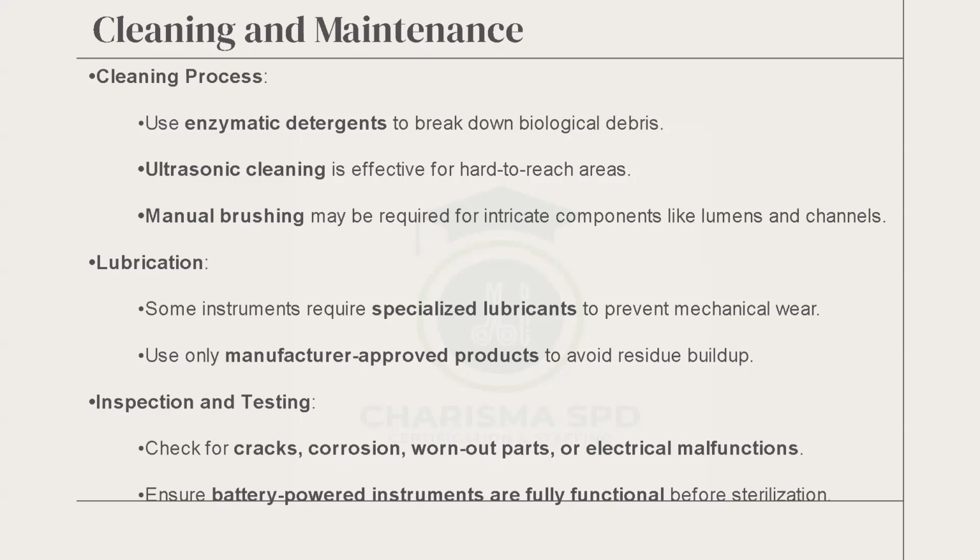Manual brushing may be required for intricate components like lumens and channels. Yes, you will have to use the appropriate brush to go into the hard to reach areas. That's what it means by intricate. Hard to reach areas, you have to use a brush. Your finger probably is bigger than the place. So use a brush to help clear the place, and then flush whatever you need to flush.